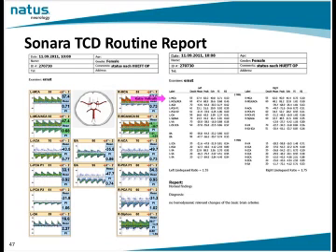You could have your Lindegaard ratio. In order for these Lindegaard ratios to show, you must have added the extracranial ICA to your MCA waveform so that the software can do that calculation. So this actually is the conclusion of our session.